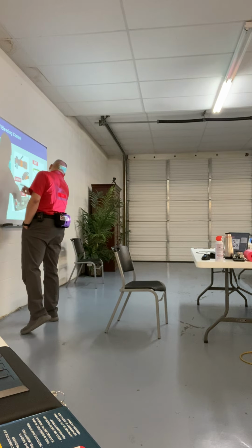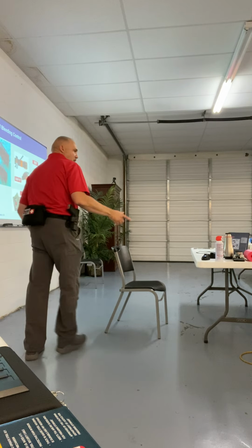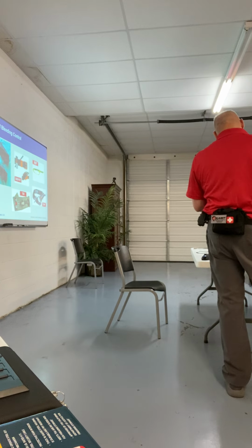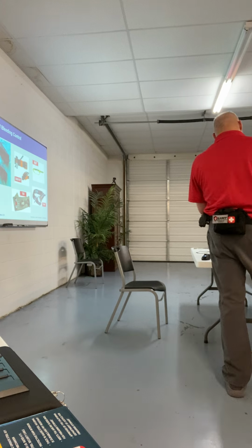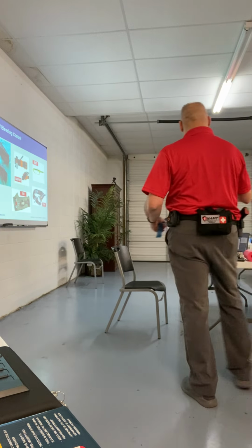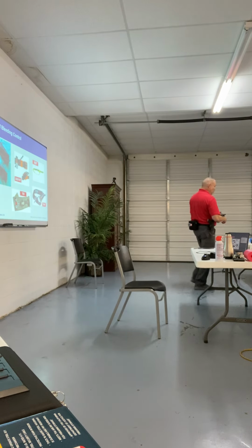This one has a ratchet and a clip. This one also has a ratchet and a clip. So they're just different. The SOFT-T, I'm going to pass that around so y'all can see that as well. Again, it'll come apart with this clip, and you can apply it to the leg and then reclip it, cinch it down, and then you start with your wings, right? This one is different because it has the C-clamp, but you're going to lock it in with this triangle. So that's why it's important to play with these and know what's in your kit, what's in your stop and bleed kit at work, at home, wherever.